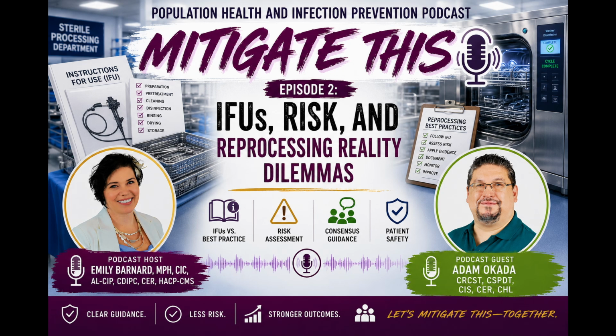The MAUDE database is the FDA database for adverse events involving medical devices. It's publicly searchable. You can Google FDA MAUDE. And you can actually get to that database and look up the adverse events for certain devices.